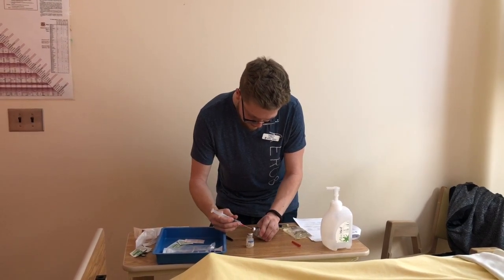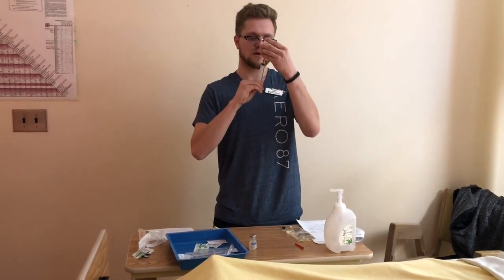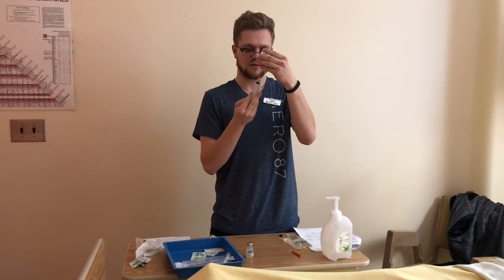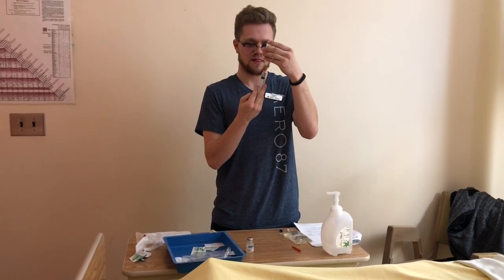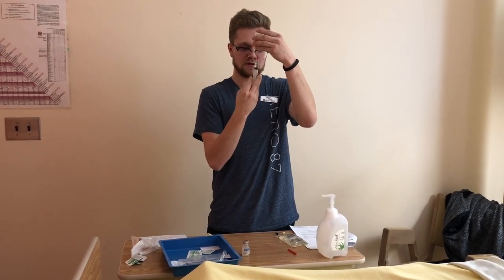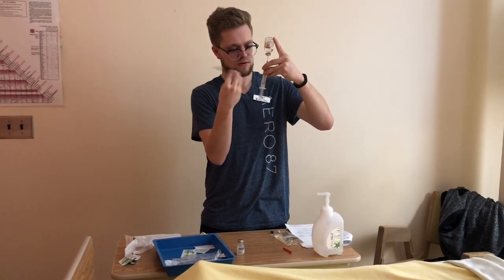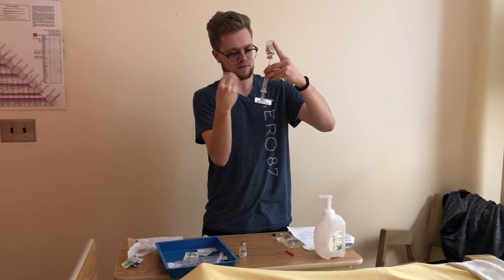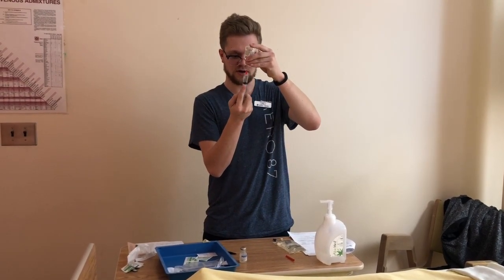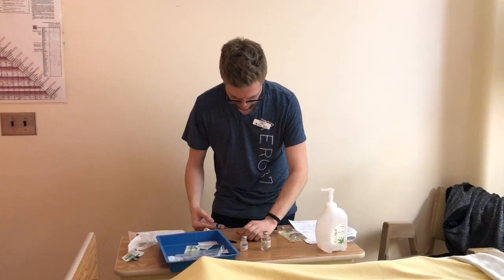Insert into there. And then insert the 4 mLs of air. And then you're going to want to draw out 4 mLs of your medication. Alright, so then you're going to have some bubbles in there as well. There we go. Okay, perfect. Make sure it's still the right amount. Okay. So now we will be recapping this again for sterility.